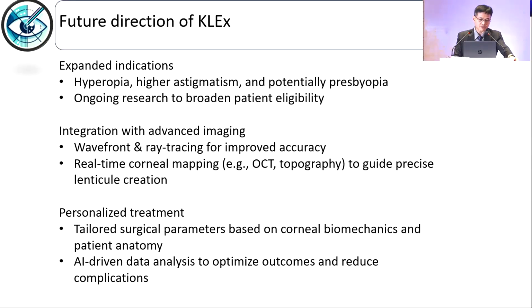So the future direction is that the procedure should be expanded to indications such as hyperopia, or integrate advanced imaging like wavefront or real-time corneal mapping. Also, personalized treatment like tailored surgical parameters based on corneal biomechanics, and in the future, we hope that AI-driven data analysis can help us optimize the visual outcome and reduce complications.